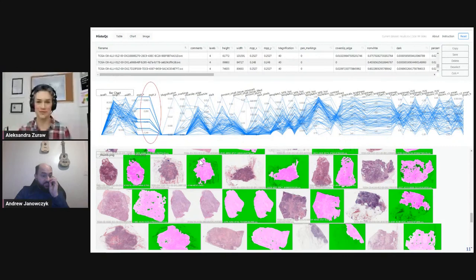But what's interesting here is this is that microns per pixel that I mentioned before. So instead of having to look at an Excel spreadsheet of 1,000 images or 10,000 images and say, is there heterogeneity in my microns per pixel? You can now look at this and I can say, oh yeah, I can see that there's about 1, 2, 3, 4, 5, 6, 7 batches of different microns per pixel, right? And now I can say, oh, there's probably 7 batch effects that I should be aware of at least, right? So this is going to help me start thinking about experimental designs.